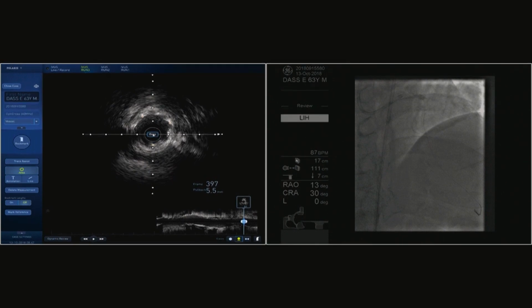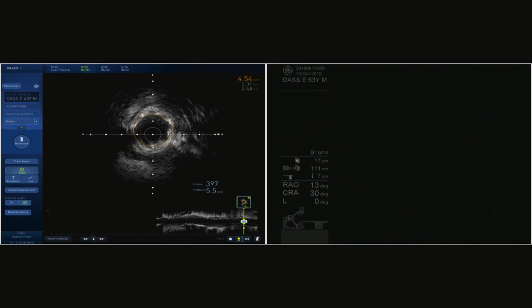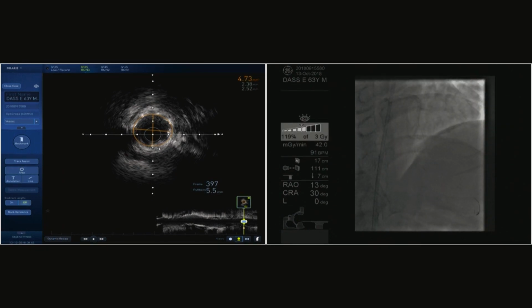Angiographically from here, it did appear to be 2.75 or 2.8, but they got an IVUS which is 2.5. So that's one of the things, when we go blindly and assume that all arteries can take a bigger stent, we can get into trouble with these calcified arteries. Sure. You can have distal dissections which you'll be chasing for the rest of the day.